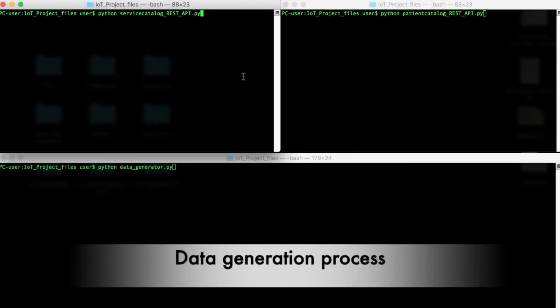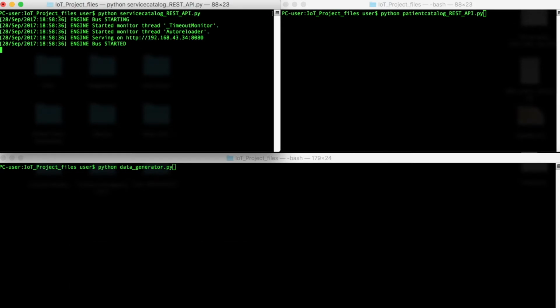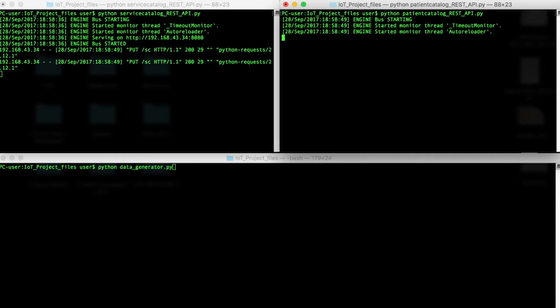First, we have to run the Service Catalog API, which is mounted on this IP address and this port, as we can see from the screen. Then, we run the Patient Resource Catalog API. After the launch, we can see how, in this particular case, two put requests are sent to the Service Catalog, in order to register the two patients in the Patient Catalog JSON file.